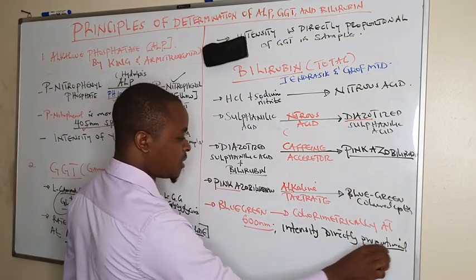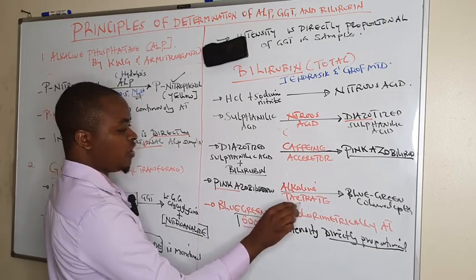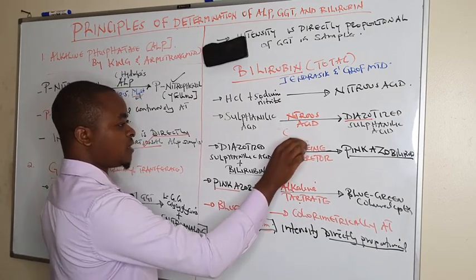So here you have to tell us it is directly proportional, tell us the wavelength, tell us the function of alkaline tartrate.